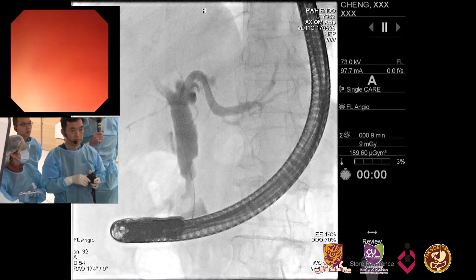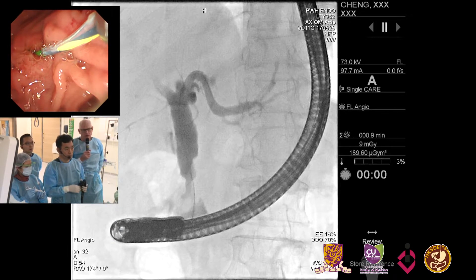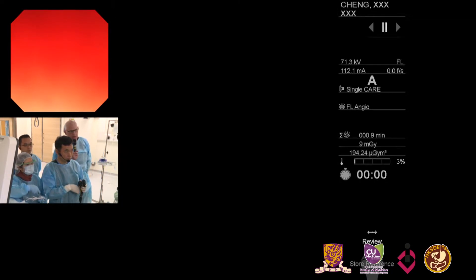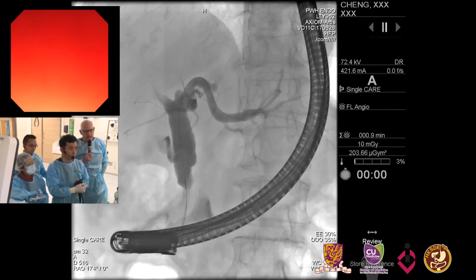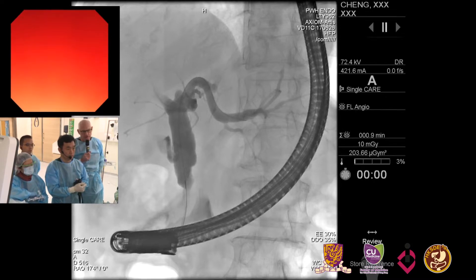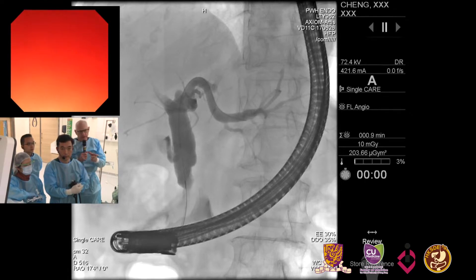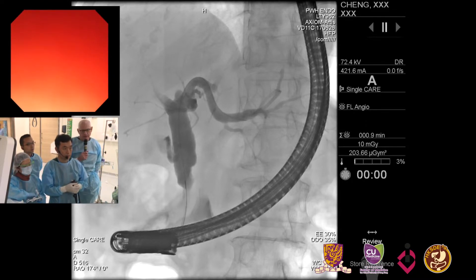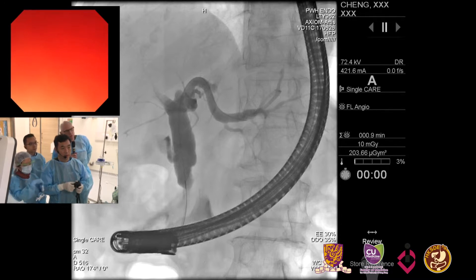Just to clarify — this conversation was had with the patient and she wanted to avoid multiple ERCPs. The data suggests the efficacy for multiple plastic and fully covered metal stents is the same, but the metal stent requires fewer ERCPs, which was what the patient wanted. What Norio is doing is very important: if we're going to use a fully covered metal stent, it's important to understand where the cystic duct takes off. If it takes off right at the top of the stricture, I'm going to be reluctant to recommend the metal stent.